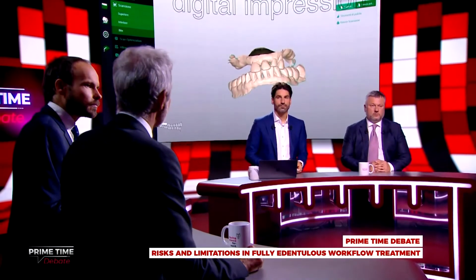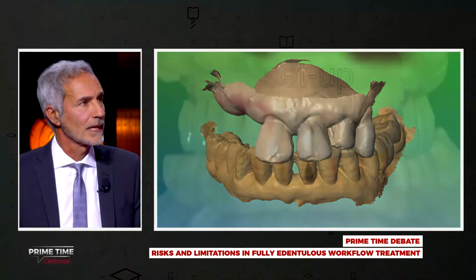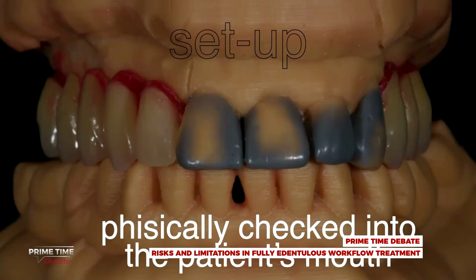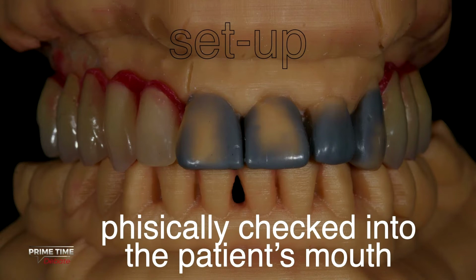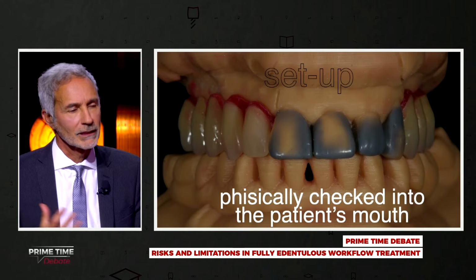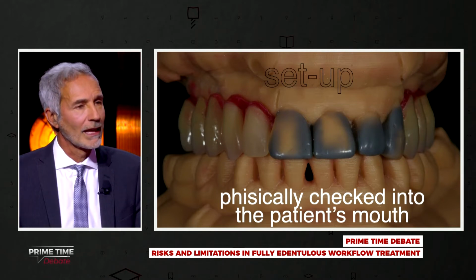The dental technician is now able to put these files into occlusion, and on this basis, the crucial point is to elaborate a setup. In my hands, as said before, the best way is to physically check it in the patient's mouth, because we have a sensation, a feeling that cannot be kept during the virtual planning.